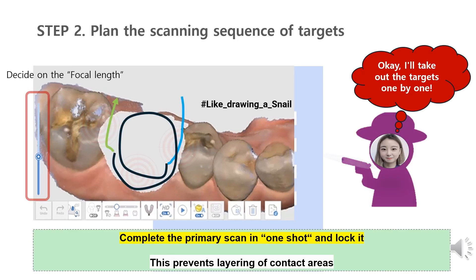Step 2: Decide on the scanning sequence of targets. For contact areas, we recommend completing the scan in one shot and locking it to prevent layering. In contrast, it is difficult for margins to get complete data in one shot. So we don't recommend trying to get a perfect scan of margins in one go — it's better to think of this as getting a rough outline in the first scan. We often start from the mesial contact, roughly scan the entire crown, and end with the distal contact. Where you start and end may vary depending on the surrounding environment.